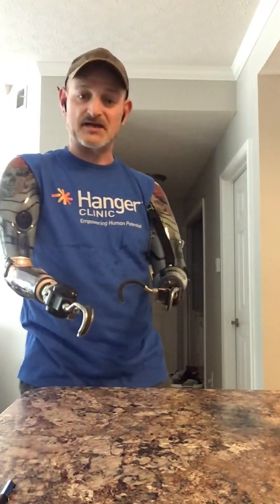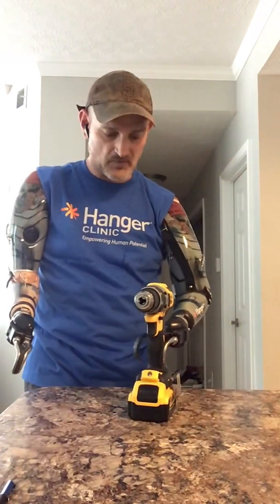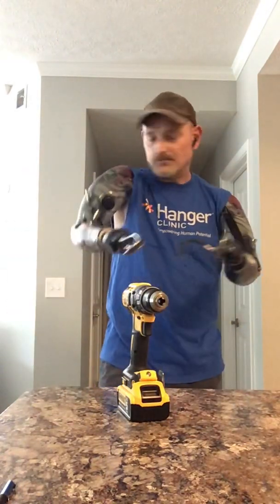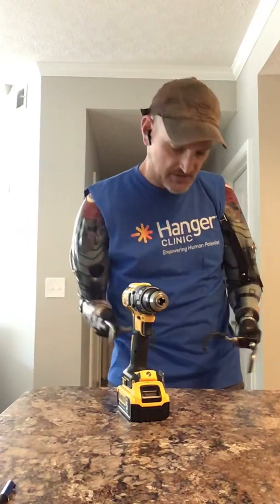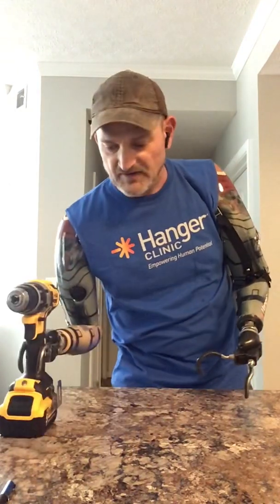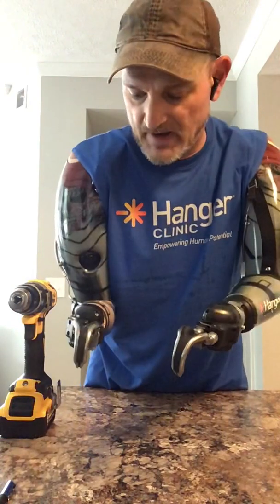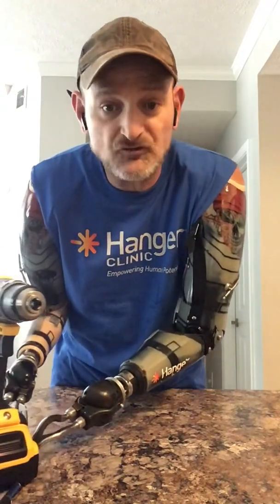One of the easiest things I can show you right now is how I hold a drill — and with the hooks, I'm going to show you how much easier it is with this hand in a minute. But first, let me give you a little rundown on how these arms work. They work off electric and body power. The electric part — when I slide into these things in the morning, I have sensors that land on my bicep and sensors that land on my tricep. All I do is flex my bicep or tricep muscle to make these hooks open and close.